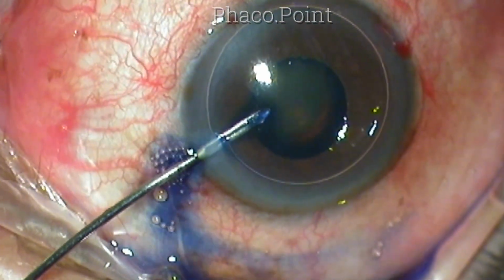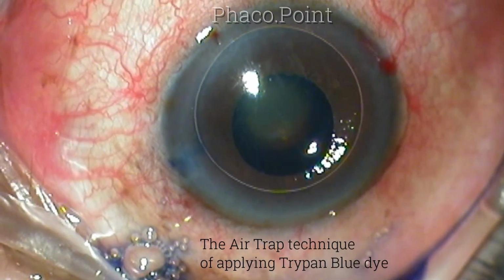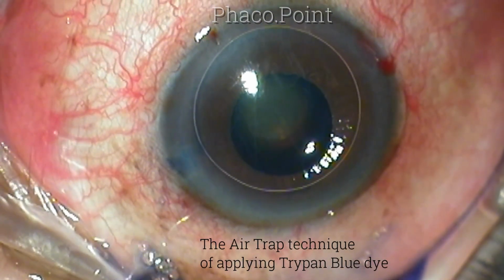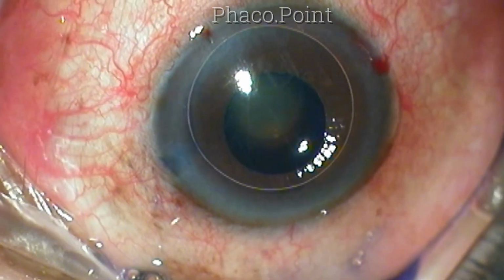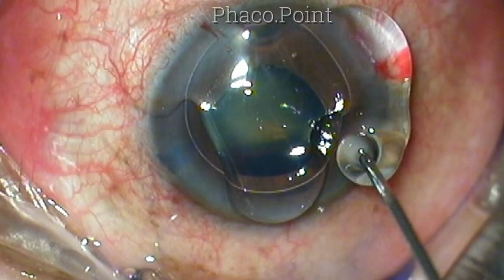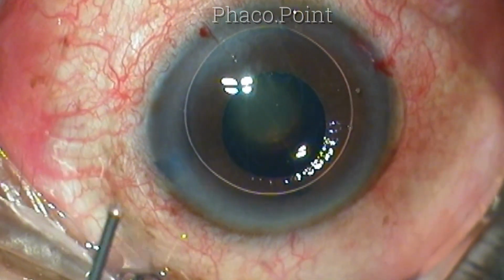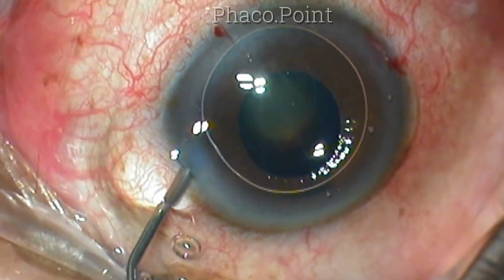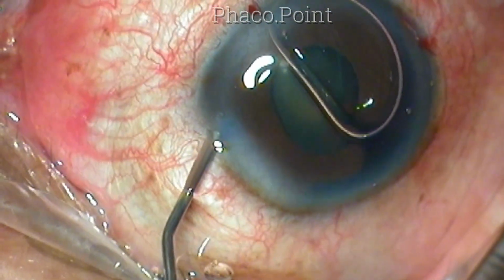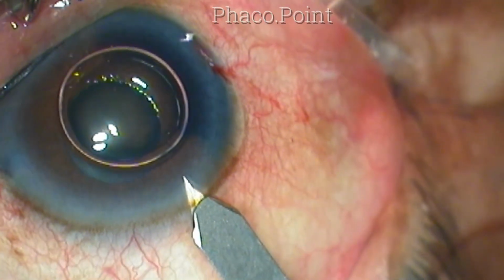The trypan blue is applied by what is called the air trap technique. This helps in small pupils. A small amount of air bubble is injected and a few drops of trypan blue instilled underneath the air bubble. The air bubble will trap this trypan blue and prevent it from escaping from the pupillary area. This will help you to stain the capsule well, and also the portions of the capsule underneath the pupillary edge.